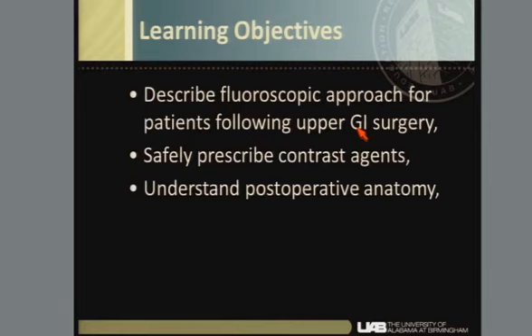I think this is key because these studies really are not protocol driven. We have to answer 2 questions definitively. Is there a leak and is there obstruction? And that is our goal. And if we are unable to do that in our reports, we have really failed our surgeons.